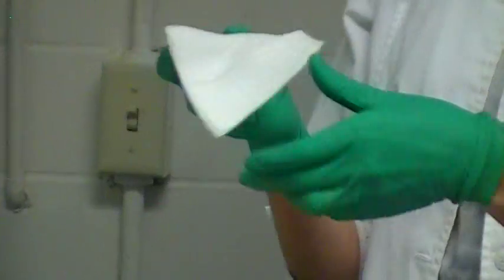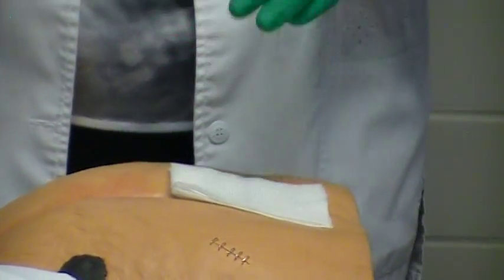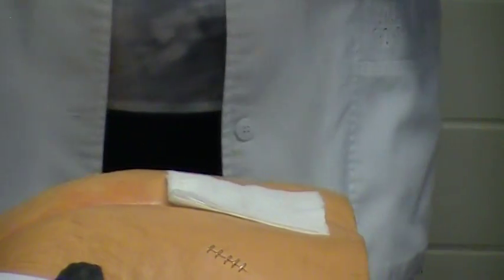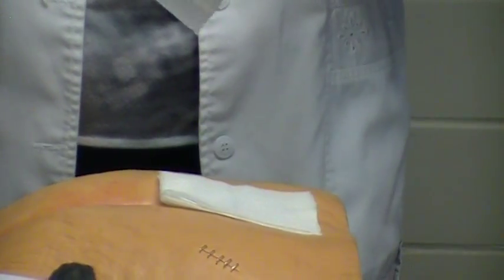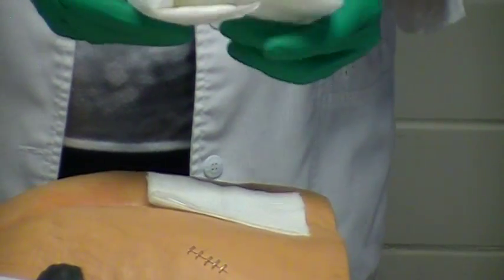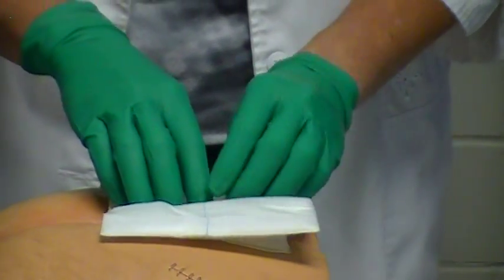Take your dry gauze and you're going to lay it over on top of that wound, just like so. Remember, the purpose of this dry gauze is to help absorb any moisture that could be present, in addition to your ABD pad or your absorbent pad that you're going to put on them. Now, when you put the absorbent pad on, you have a couple of options. You can lay it straight across. You can fold it to where it's more the size of the wound. Whatever seems to be appropriate for that dressing, okay? So I'm going to just lay it straight across like we had on the previous one.